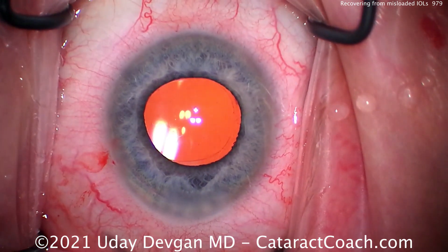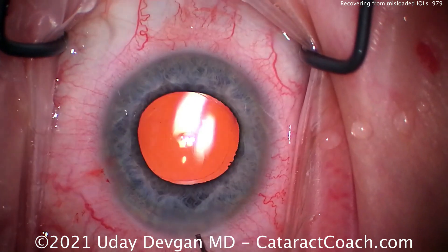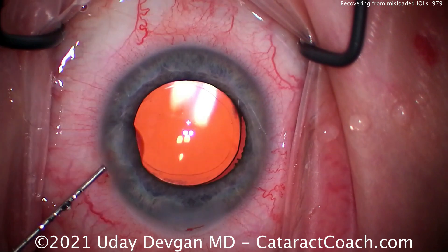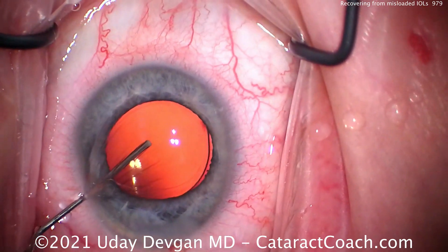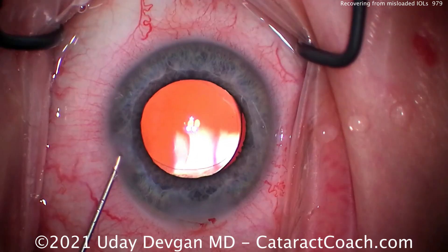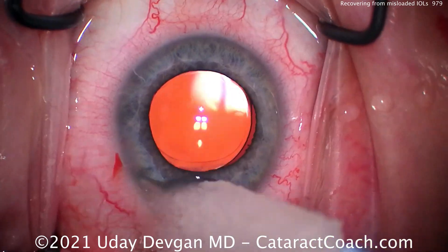Of course, it's the reverse — or anti-S. If the haptics look like the letter S in the eye, that may mean S is for silly or stupid mistake, because that's likely going to be upside down. So finish up the case here. I just want to emphasize the point — you've got to be prepared for anything when we do cataract surgery. Every case is unique. Why are we still so entertained doing this surgery, even after tens of thousands of surgeries? Because of that variability. It's a beautiful surgery. It takes years to learn and a lifetime to master.